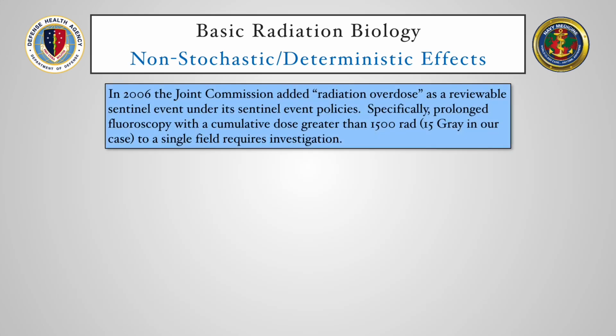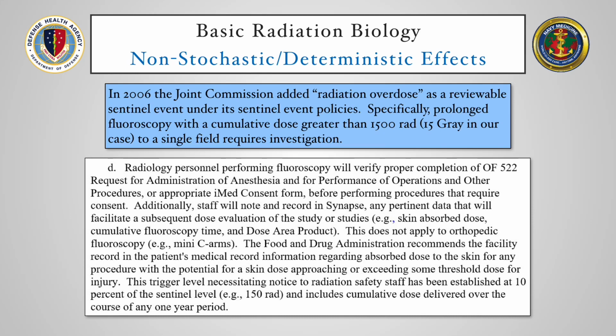In 2006, the Joint Commission added radiation overdose as a reviewable sentinel event under its sentinel event policies, specifically of prolonged fluoroscopy with a cumulative dose greater than 1500 rad or 15 gray in our case to a single field. Each facility is different, but at my facility, we have established a trigger level of 150 rad or 1.5 gray cumulative dose to a single field. This trigger necessitates notice and involvement of the radiation safety officer for patient safety considerations. So you should be asking, has your facility instituted any policies to trigger possible patient safety risks?